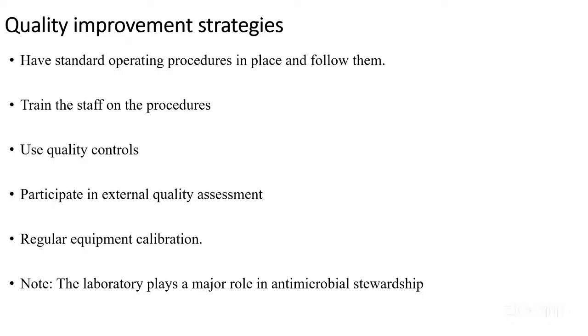Make sure everything that you are using is fit for use and it is not dragging you behind in matters of quality. And we should always note, as lab technicians, lab technologists, lab officers, lab scientists, we play a very major role in antimicrobial stewardship. We are the gatekeepers of antimicrobial resistance stewardship because we are the ones giving these doctors information on how these bacteria are behaving, how these bacteria are changing. And so we should be very careful in our processes. If we mess up, we also mess up the patient because the doctors will use our reports.